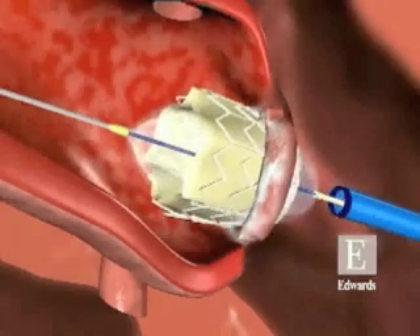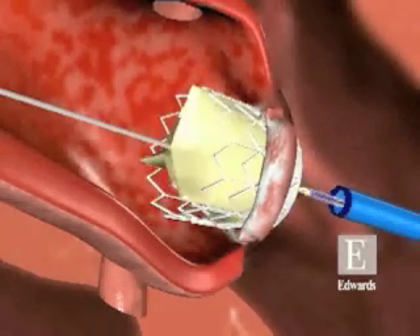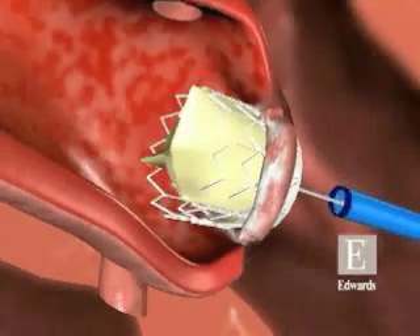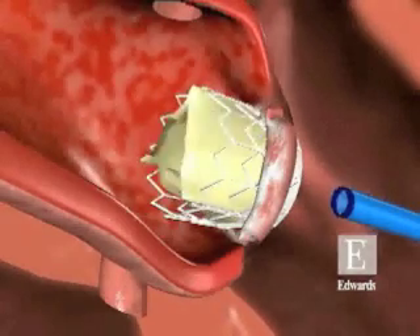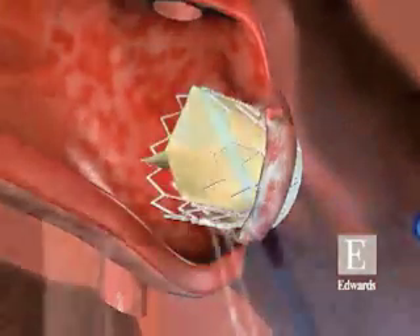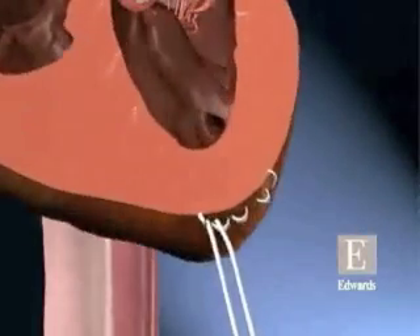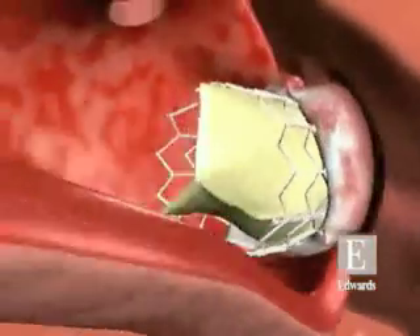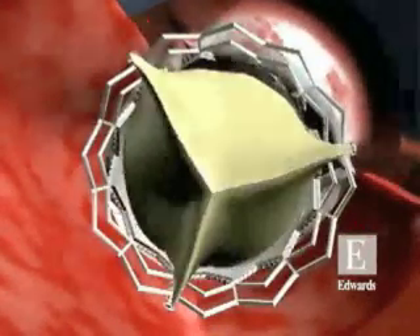A larger catheter is now placed and the transcatheter heart valve mounted on a balloon is deployed in the native valve. The introducer is then removed, the incision in the apex of the heart is closed, and the transcatheter valve is now functioning in replacement of the native valve.